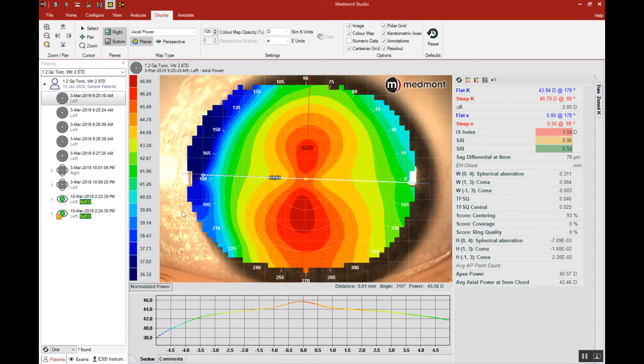This video reviews the pupil definition tool available in the Medmont Studio software.